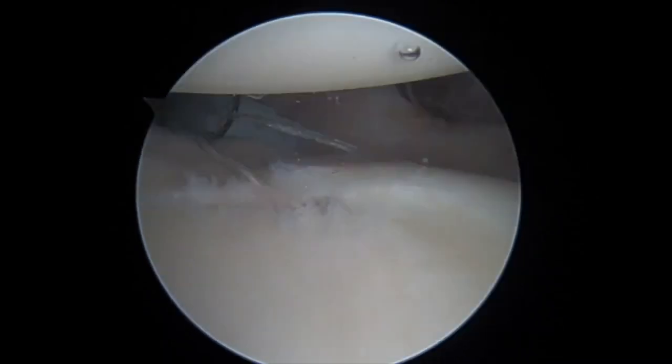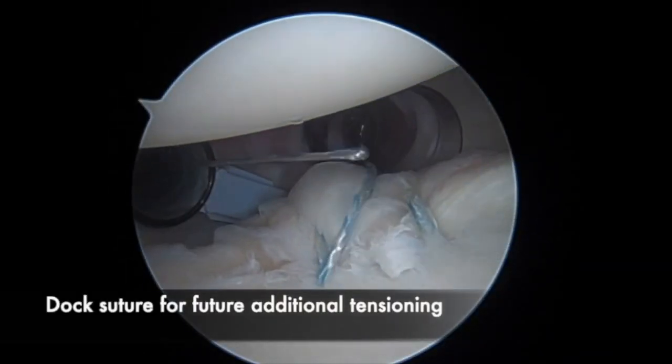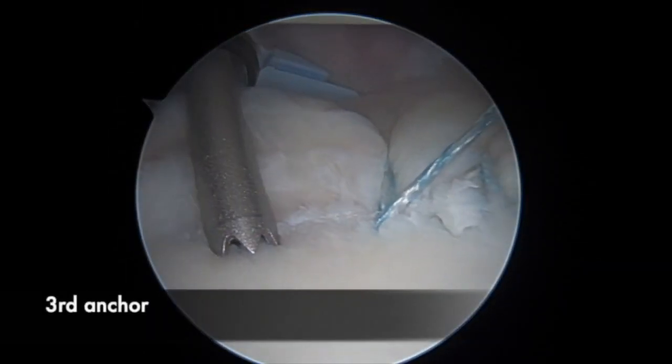Importantly, the tensioning stitch is maintained and not cut so as to allow for sequential re-tensioning after placement of additional anchors.